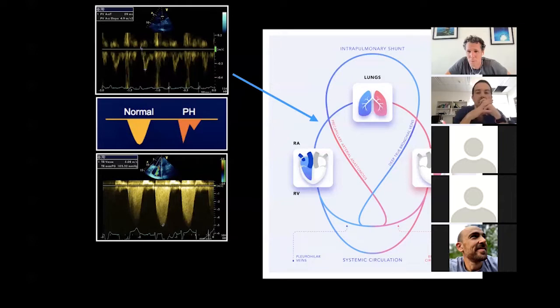Vishal, how do we do mean pulmonary artery pressure? So it's the same from the PR jet. The early peak is the mean, the late peak is the diastolic. Excellent. Is there any other way you know? You can just do the VTI of the TR. Okay, yeah. Is the other one there? And then you use the mean gradient. I was going to say from the pulmonary valve acceleration time also.